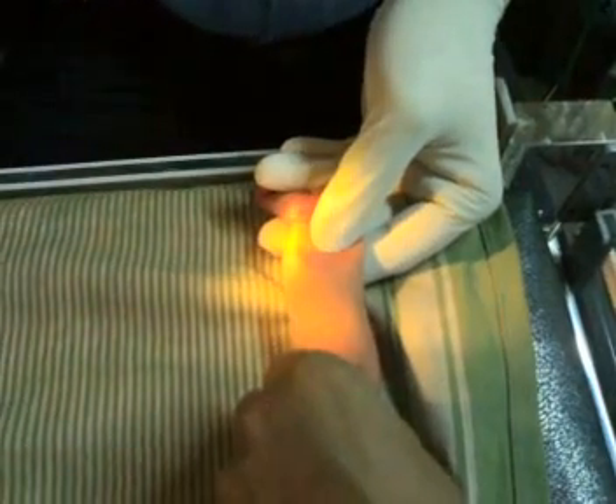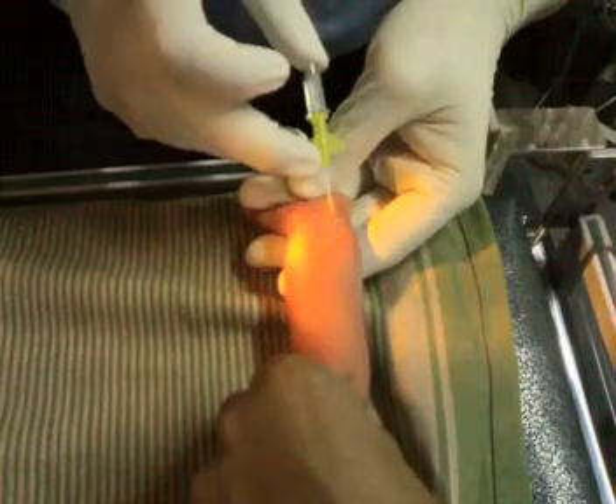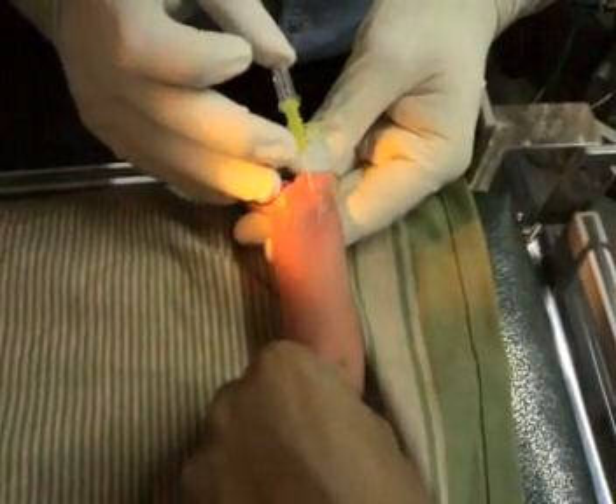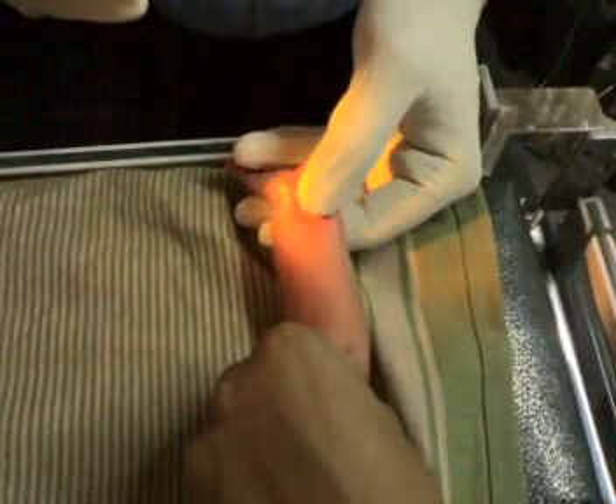You can see that the artery has become visible here, and what I will do is just cannulate the artery. Once more I will show, for the sake of the students here.